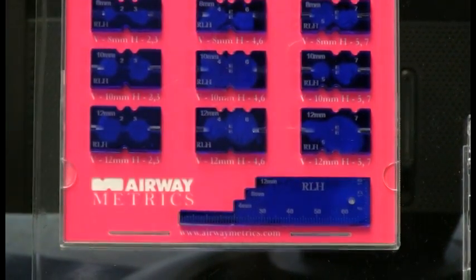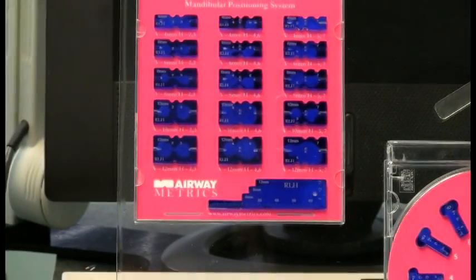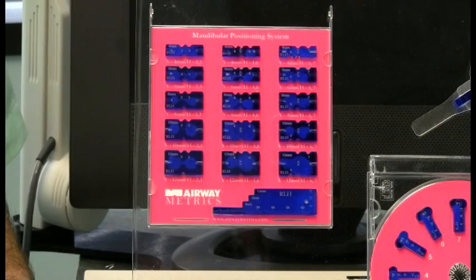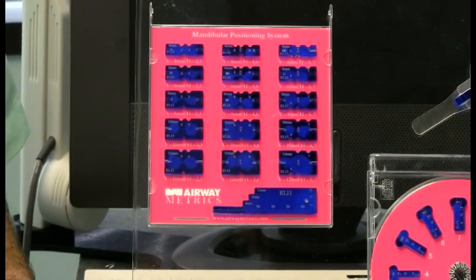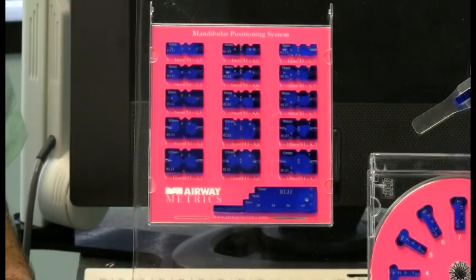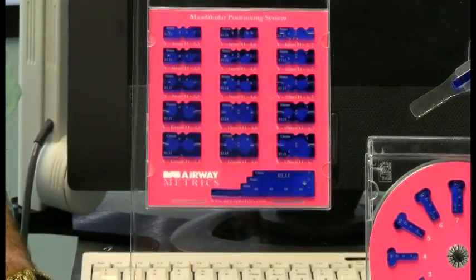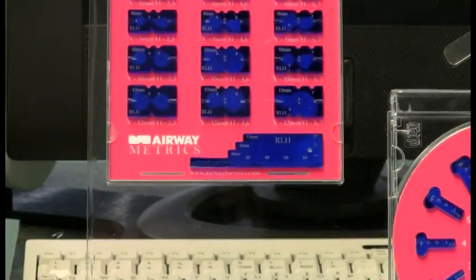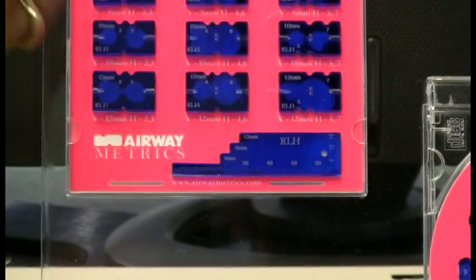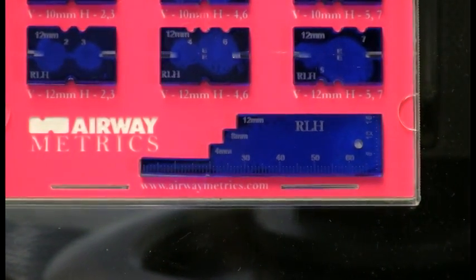The increments in here, with these 15 pieces of plastic, allow the mandible to be positioned in over 50 different positions from centric to plus 7 millimeters on the AP scale. However, using the Snore simulator defines the general area to be more carefully measured, and so rarely are more than 4 of those simulators required.